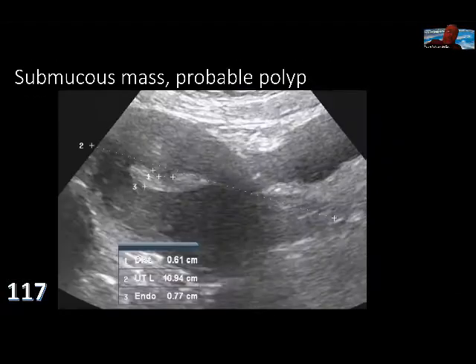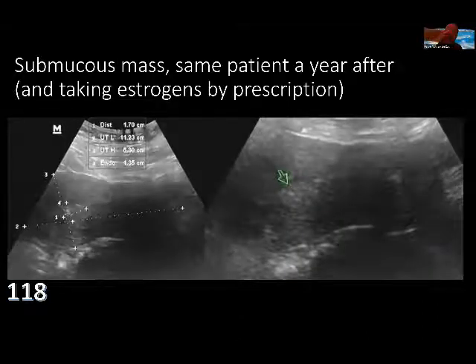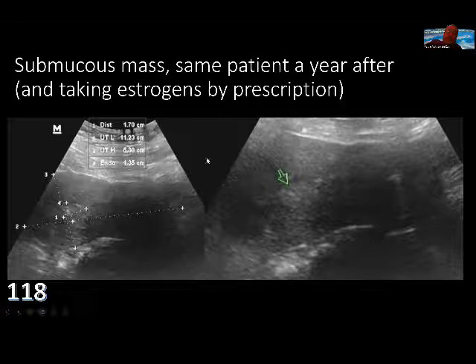Same patient as this. The poor lady, I say, she has something there. Then somebody put her on taking estrogens. Still a year after, abnormal bleeding and something in the endometrial lining.